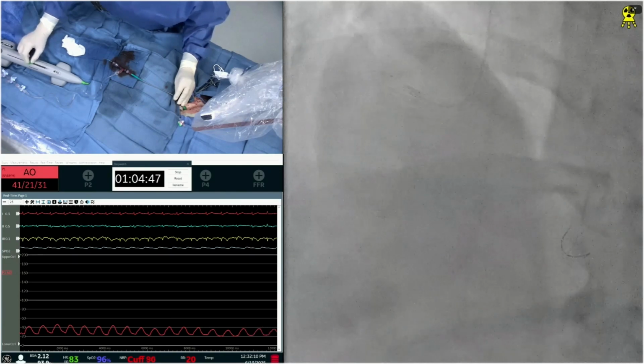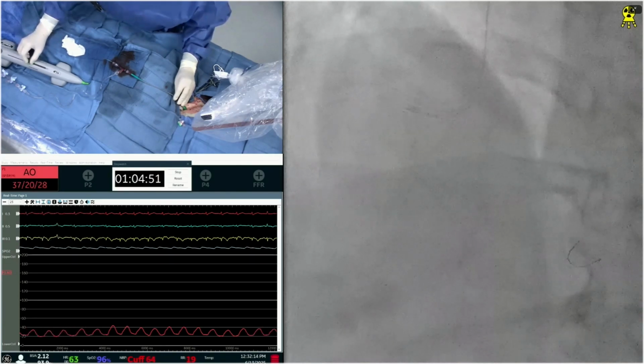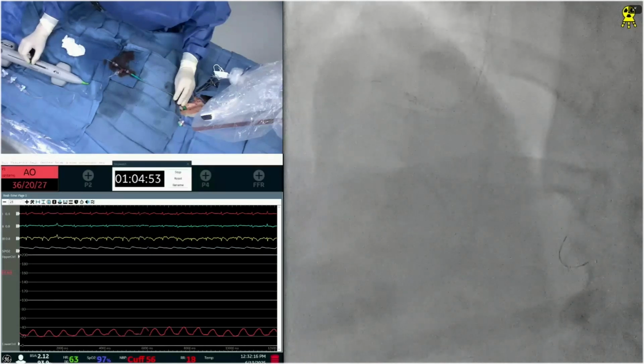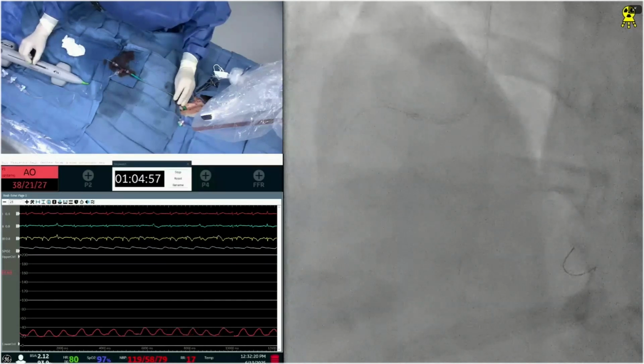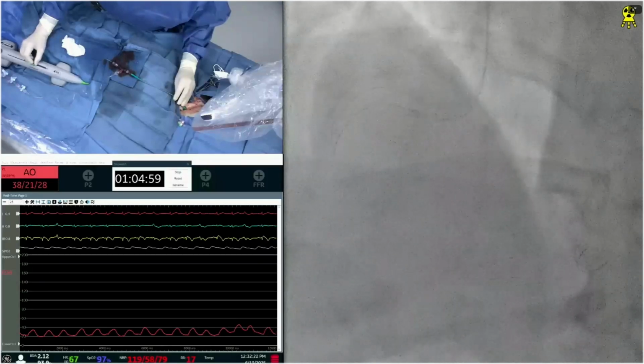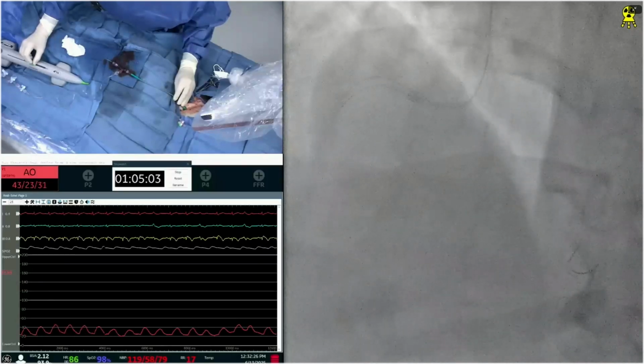I do it for the fellows because they may go into the distal part of the wire. You've reduced your cases, go ahead. I was just going to say, one of the biggest benefits of the availability of orbital atherectomy is that it forced the evolution of rotational atherectomy. So it made RotaPro, which was, I think, a good outcome.